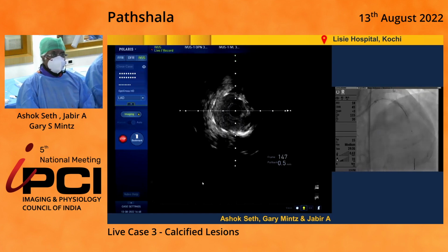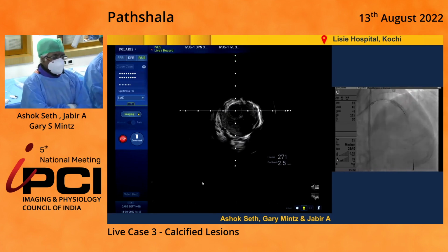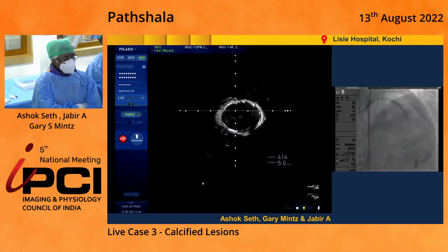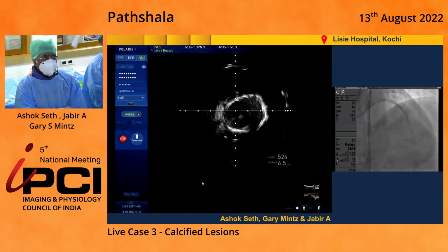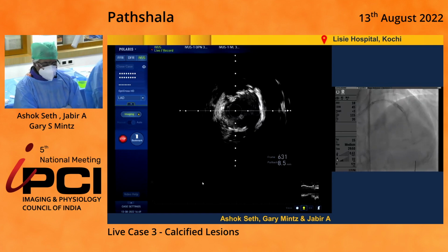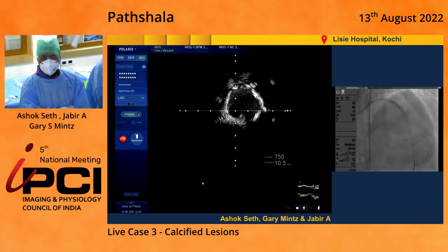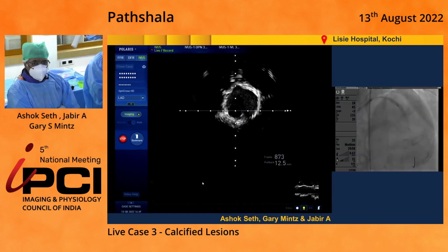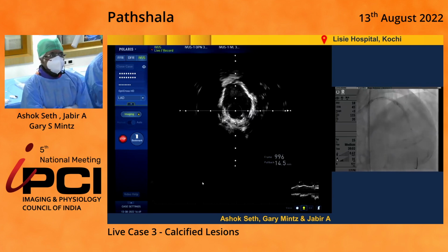And surprisingly, in that registry, which is multicenter, core lab but not protocol, two layers of stents was not one of the only two variables associated with failure, which was interesting. I would have thought two layers of stents would not allow us to get to the calcium outside.